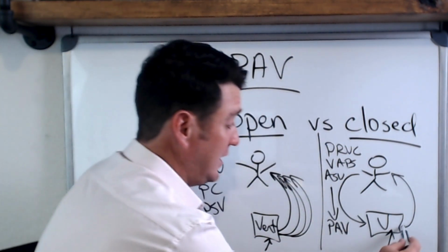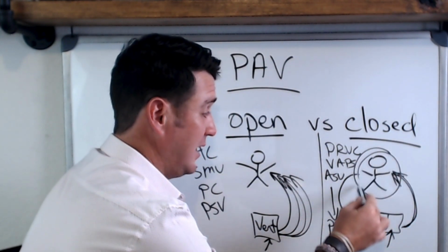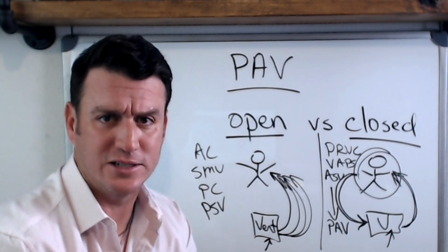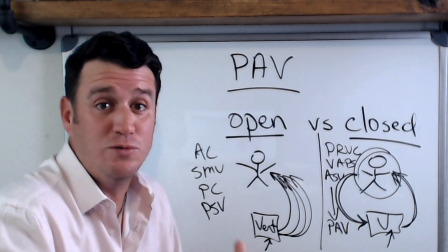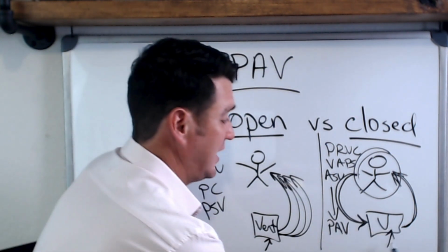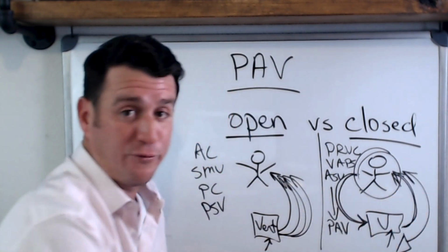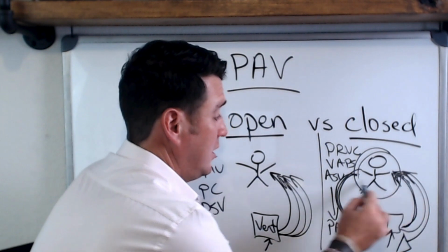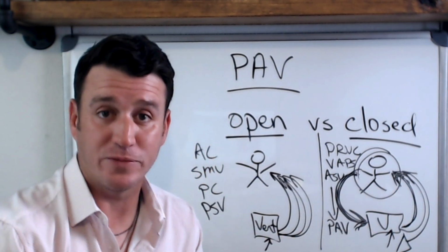Okay, so the vent does what it's supposed to do. The patient responds. The patient says to the vent, obviously not consciously, this is subconsciously, hey, this is what happened when you did what you were supposed to do. And the vent says, no worries, I'll make a change and I'll do something different. And this feedback is continual. So the vent automatically adjusts to the patient, okay?